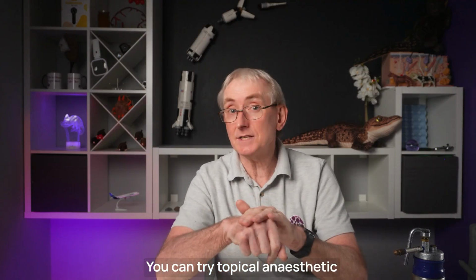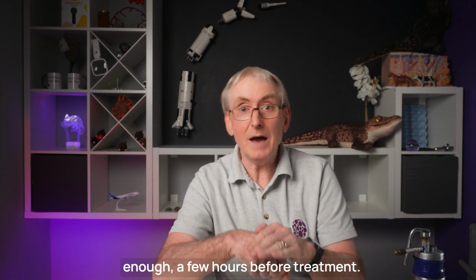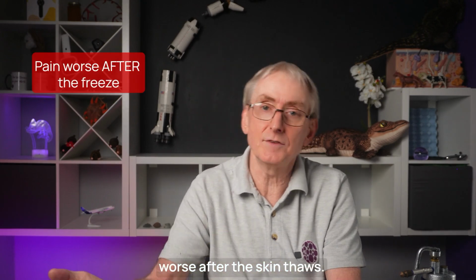You can try topical anaesthetic creams beforehand, using cling film to keep the cream on the skin for long enough, a few hours before treatment. Freezing involves numbing nerve endings. Therefore, the pain is worse after the skin thaws.